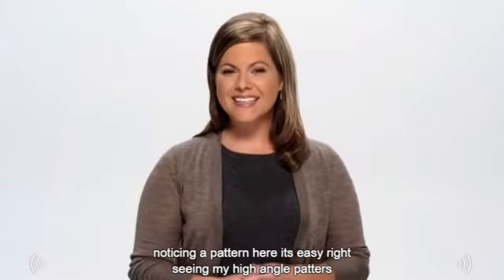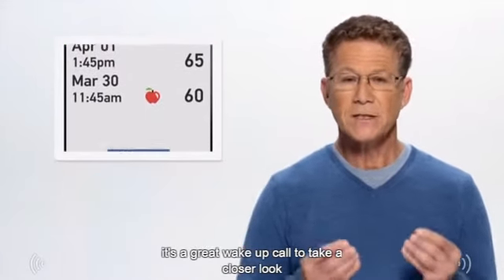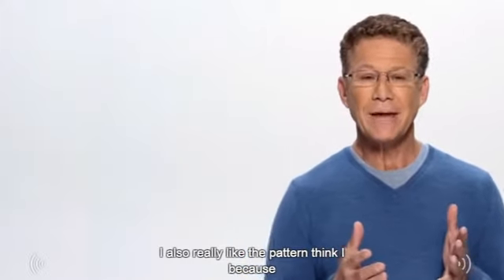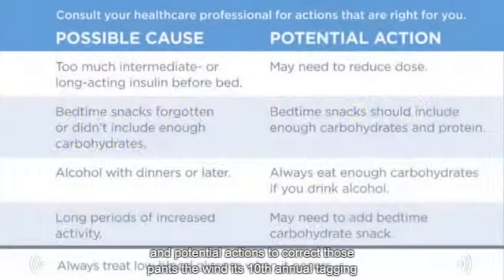Noticing a pattern here? It's easy, right. Seeing my high and low patterns as they happen is something I think all people with diabetes can benefit from — it's a great wake-up call to take a closer look. I also really like the pattern guide because I think it's a nice teaching tool to help people start thinking about possible causes and potential actions to correct those patterns.